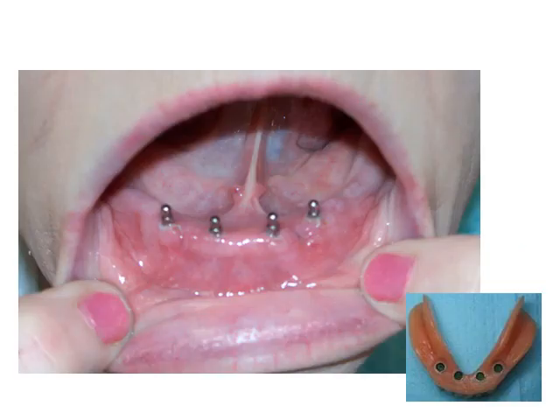This picture is showing you an implant setup. It appears that there are 4 implants placed in the lower mandible, and it's to hold in a whole lower mandibular arch of dentures. If you see down here at the bottom, right here, that fits right on top of the arch, and it is removable, so they can take that off and clean underneath this particular type of implant setup. So again, we're going to just keep looking at different types of implants, and you might encounter them in your practice.